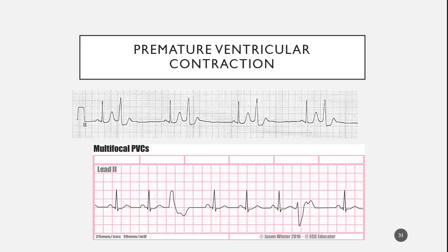So atria fires, QRS depolarizes, we're repolarizing, now we're waiting for it to begin again, and we have pause, pause, pause, pause. Another part of the heart says, okay, I guess it's up to us, we're going to have to do something. And as a result, then we will begin to see either a junctional escape beat or a ventricular escape beat coming into play there.